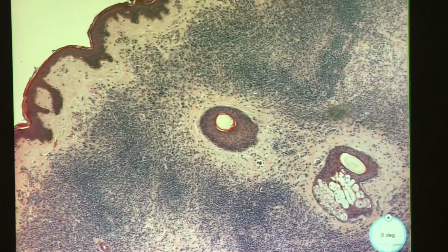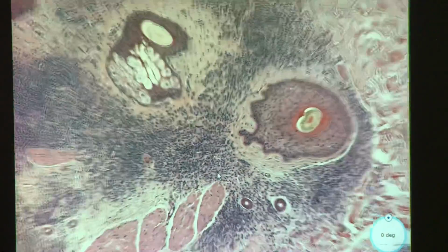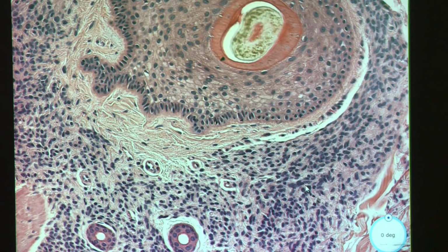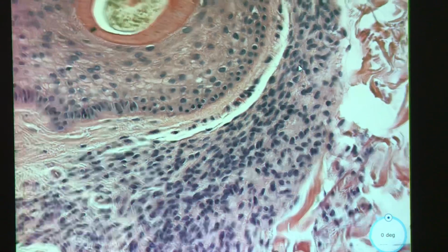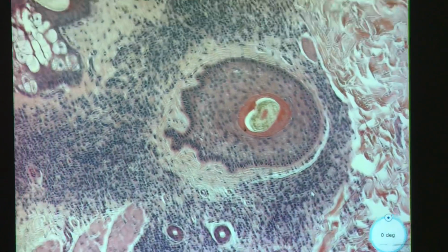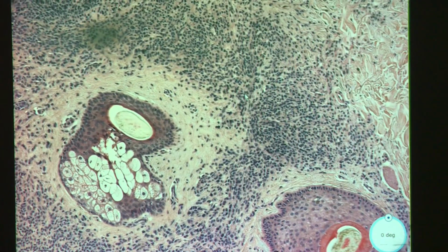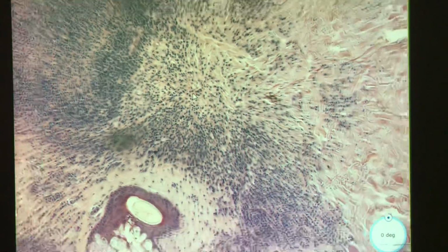Other things we'd want to take a look at with these kinds of lesions are if they involve things like hair follicles or adnexal structures, and what we see is the same cell population going underneath these structures. When you see these spindled cells that may or may not have pigment in them, and may or may not be vacuolated, these are melanocytes, and when they go underneath adnexal structures, we call that congenital features. So what this actually is is a congenital nevus.